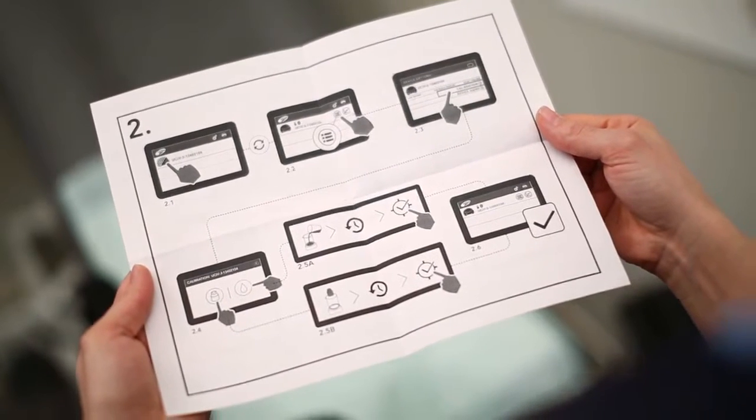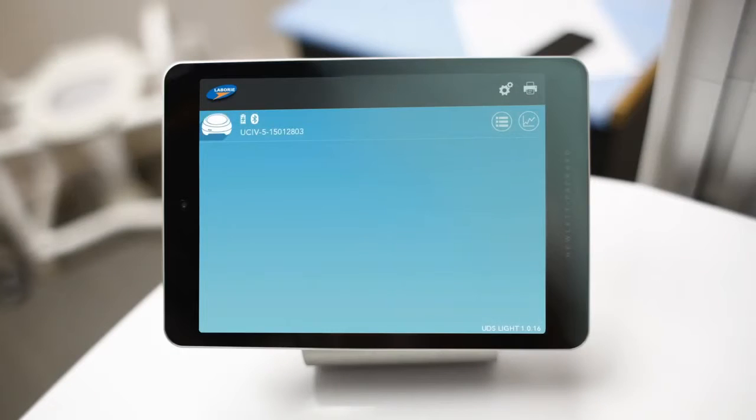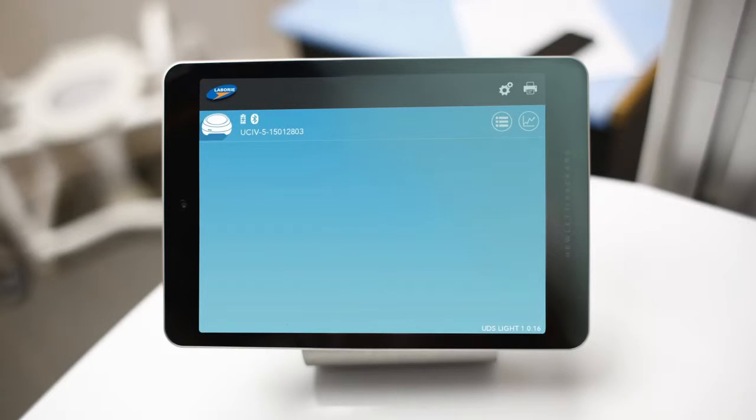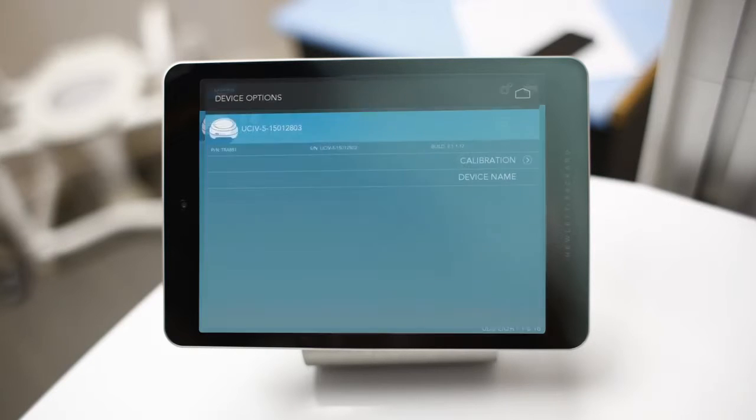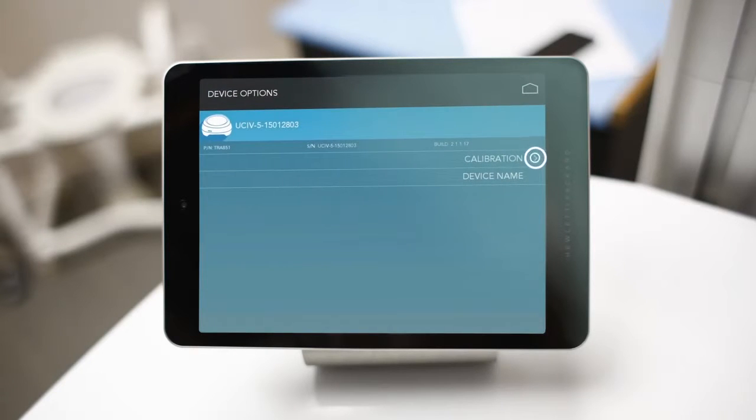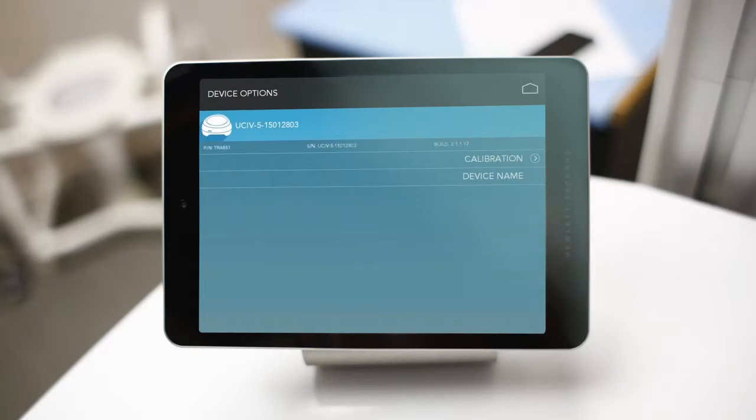To begin calibration, select the device options icon from the home screen. Next, tap calibration within the device option screen.